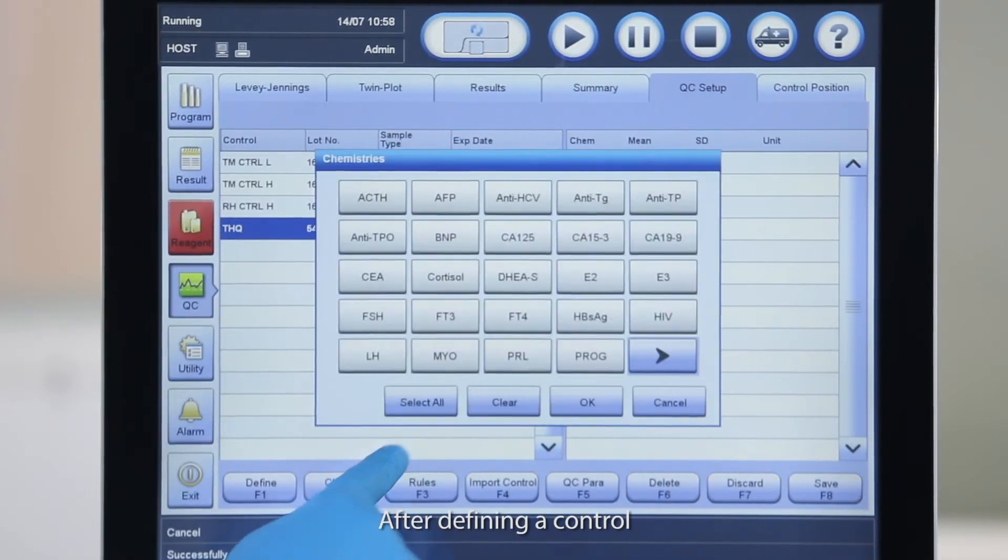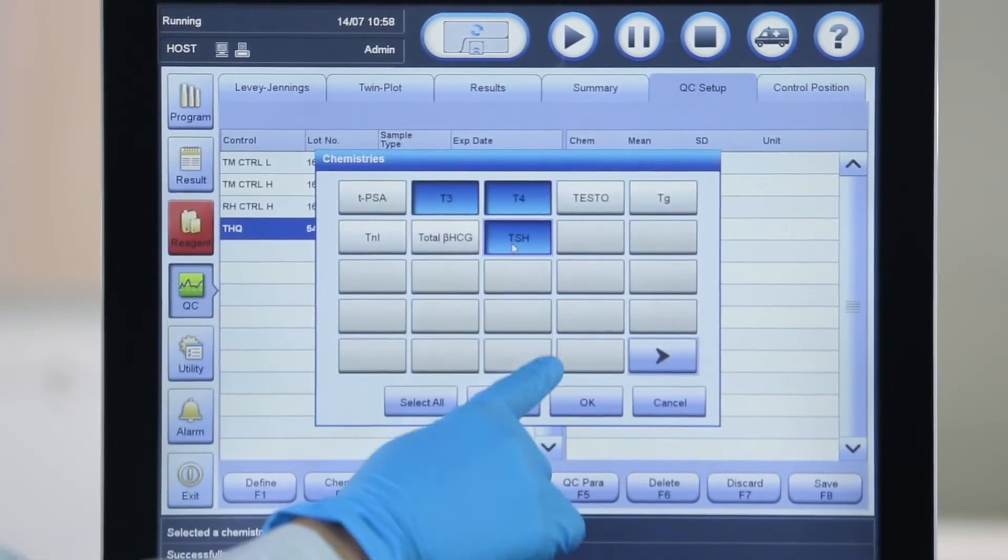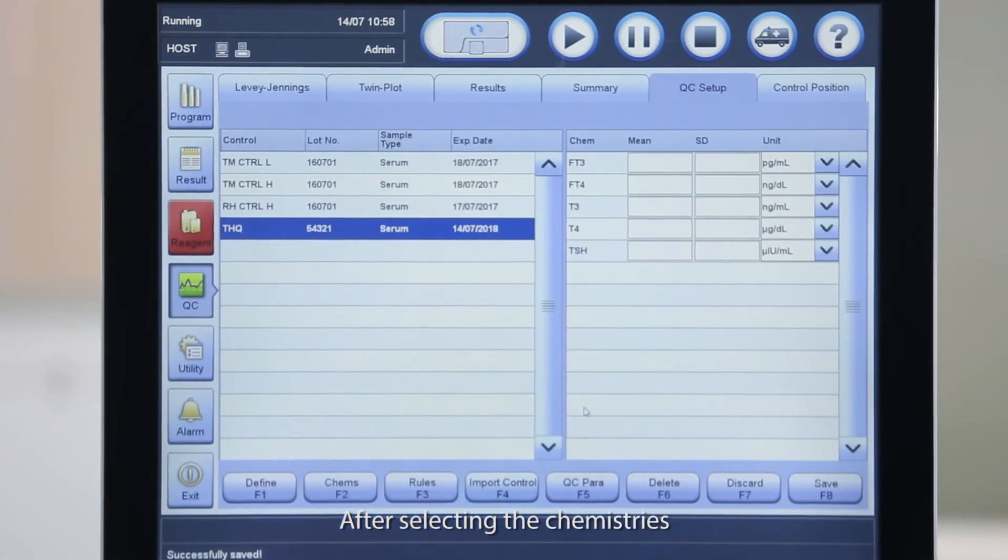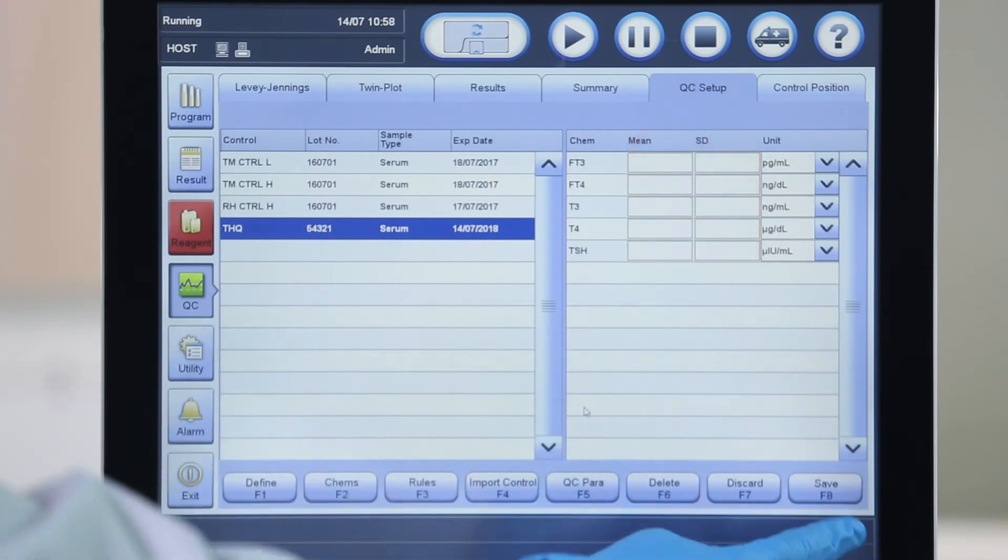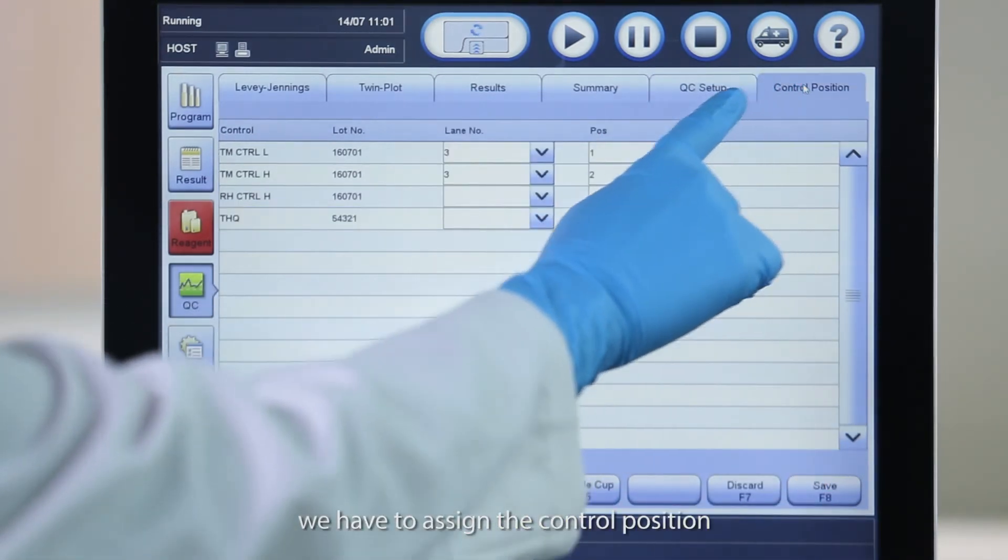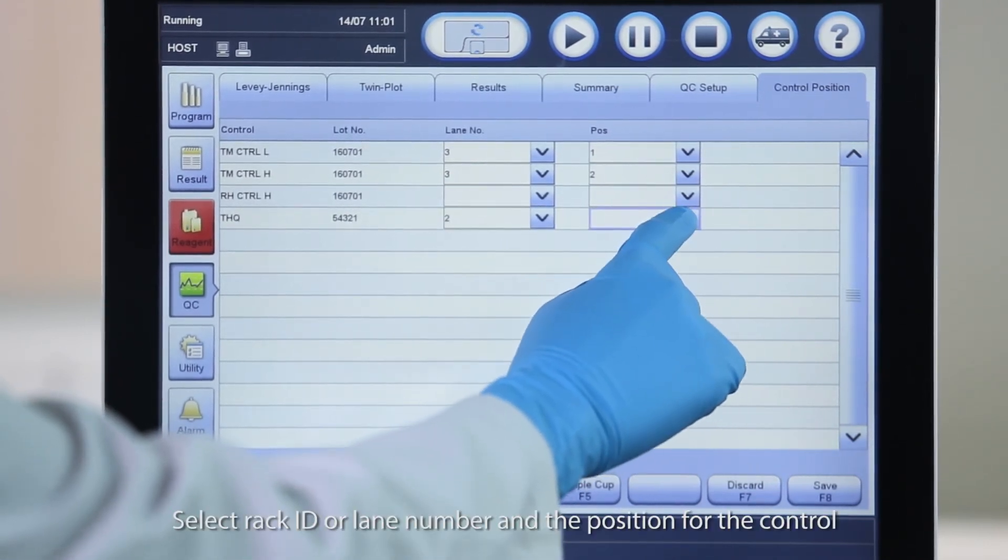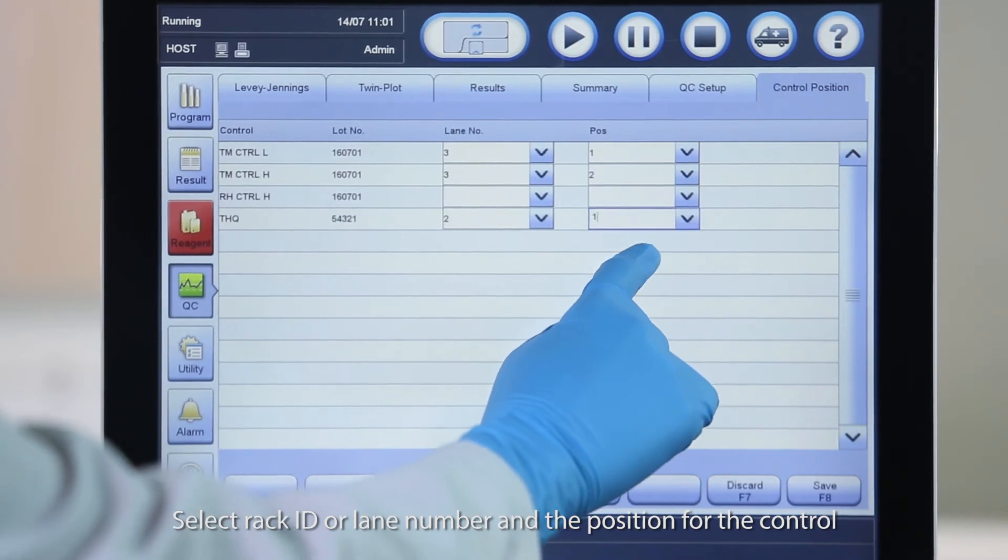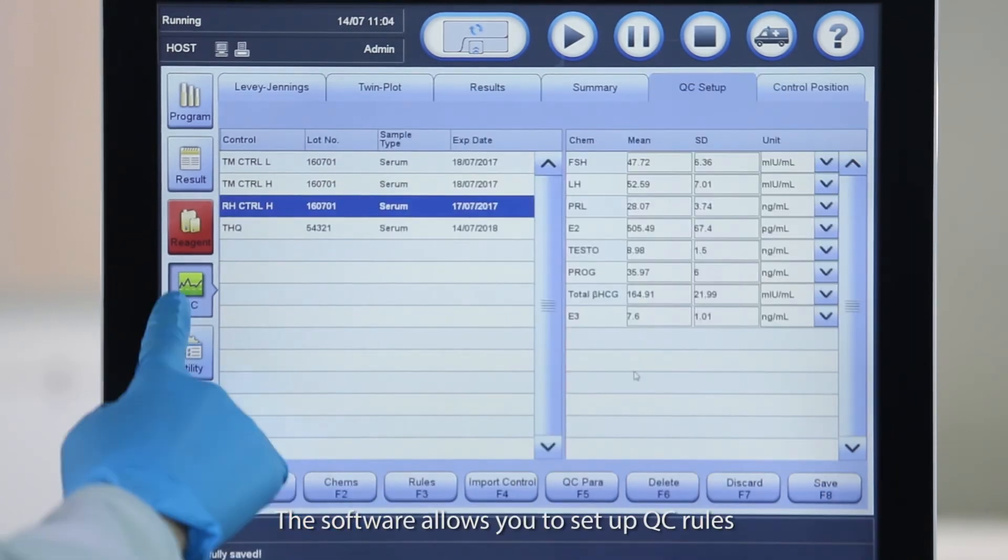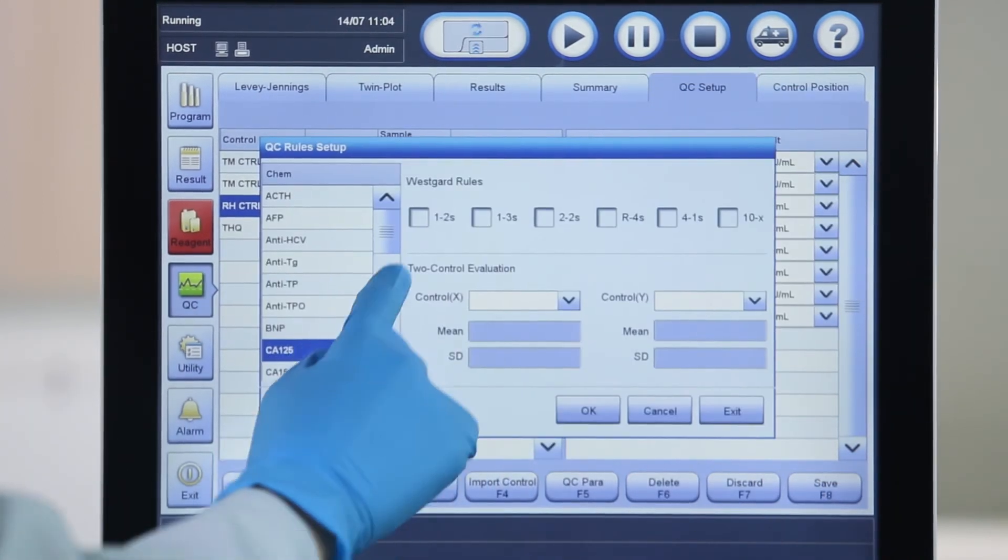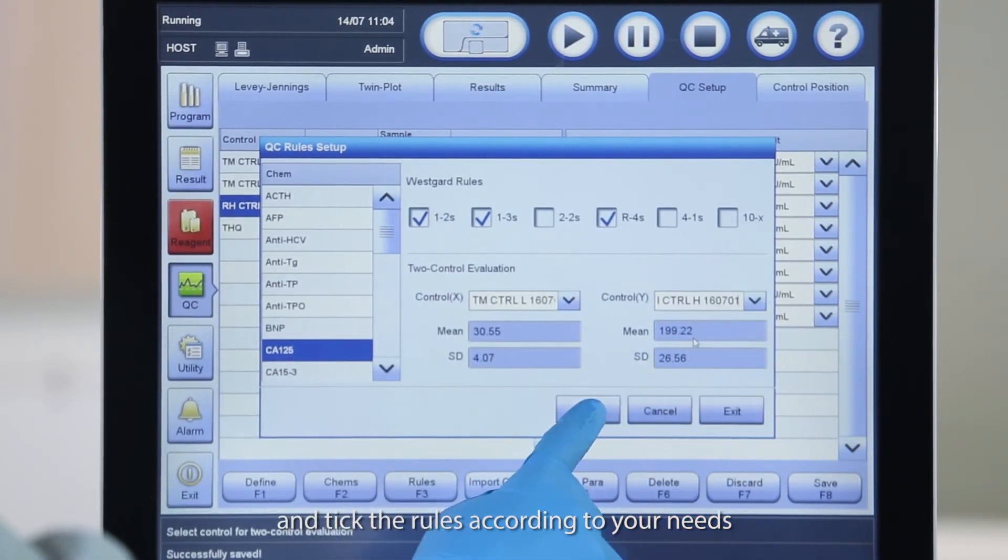After defining a control, you need to select chemistries for which the control will be used. After selecting the chemistries, we have to set up the control concentration and SD. Just like calibration, we have to assign the control position. Go to Control Position page. Select Rack ID or Lane Number and the position for the control. The software allows you to set up QC rules. Open the QC rules setup page and tick the rules according to your needs.